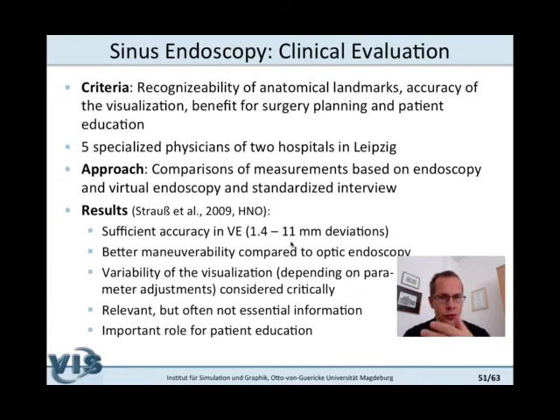And compared to this, of course, even 140 surgeries distributed over 5 physicians is not so much. So basically they said it's not too much additional information that we get. But, and that was the most favorable result, basically they all commented that the patient consultation was improved.